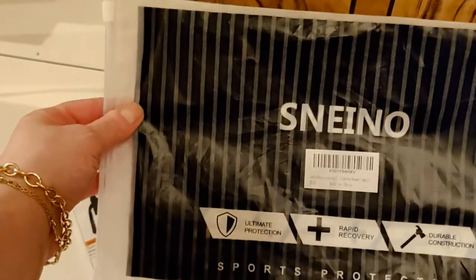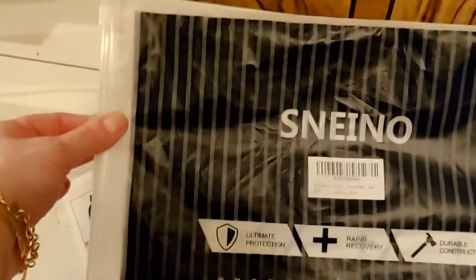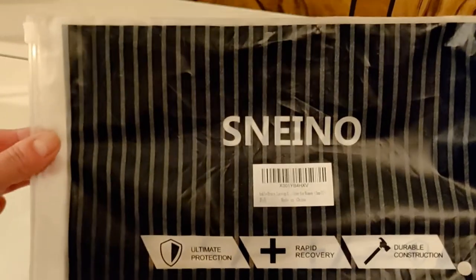Hi everyone, I just received my order of the Snenyo Ankle Brace and I thought I'd give it a quick review, and we can open this together and share.